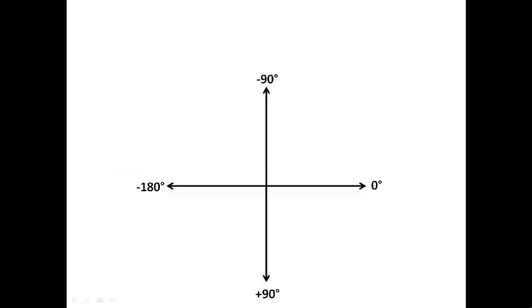Of course, we know this famous diagram which we have seen in the lectures on the basics of the ECG, and I just want to emphasize first, so that no one is confused today, that when I say the left upper quadrant or left lower quadrant, let's imagine that you are seeing an image. Because, for example, if you are seeing a patient in front of you and you use your right hand to point to his heart, the left side of his heart is at your right hand and the right side of his heart is at your left hand.